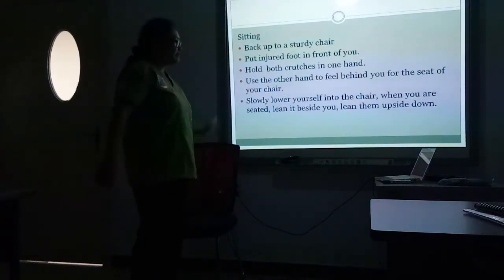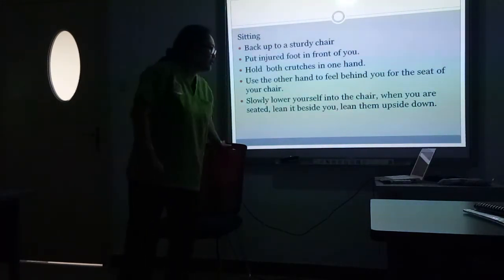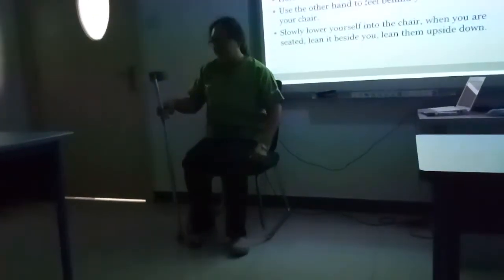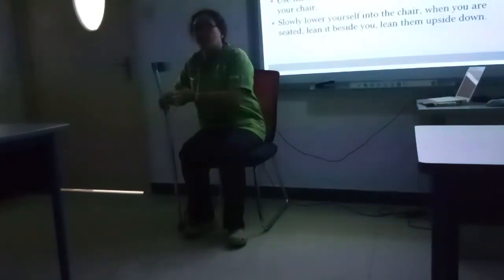Sitting, okay. Back to the sturdy chair. Put your foot in front of you. Okay, hold both crutches. Sitting tayo. Yung pasyente, nagsisit. Dalawang saklay, ilagay dito both.